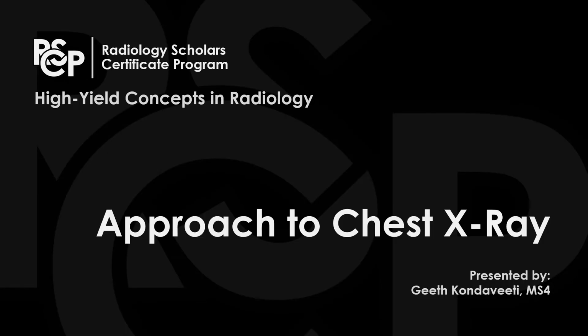Everyone, and welcome to a presentation on approach to chest X-ray. We'll start with talking about some basics and move on to talking about a search pattern you could use.